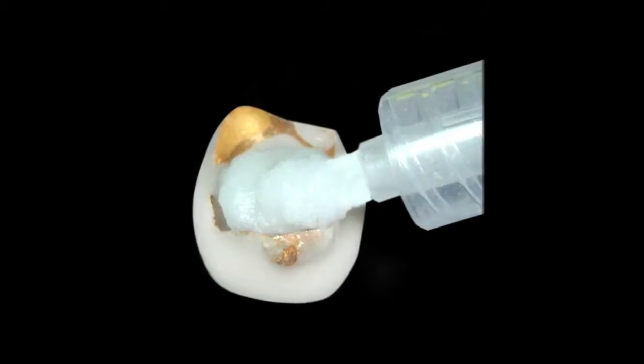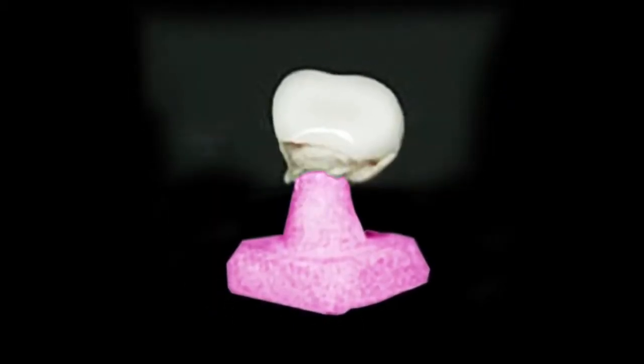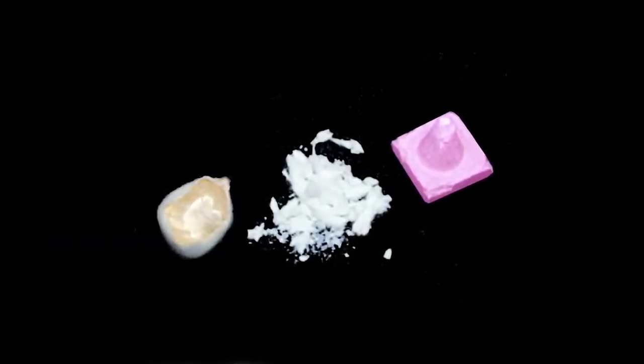How you use the product is you take the 12cc syringe that Wonder Peg comes in and you squirt a small amount inside of the crown and then you place the crown on the firing peg, on a ceramic firing peg, and you let the crown set there and it stabilizes the crown during the firing process. And when you remove Wonder Peg from the oven, just the cool air itself will actually cool the Wonder Peg and cause it to nicely crumble out from inside the crown.